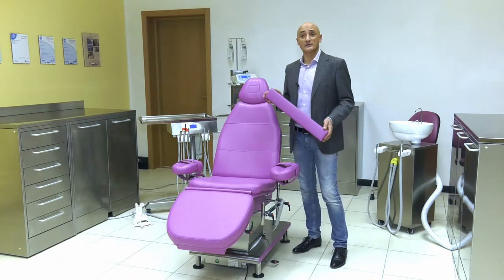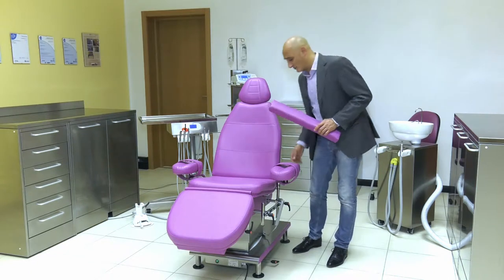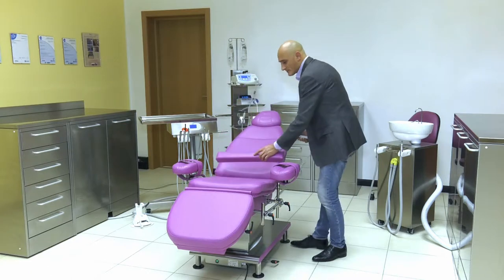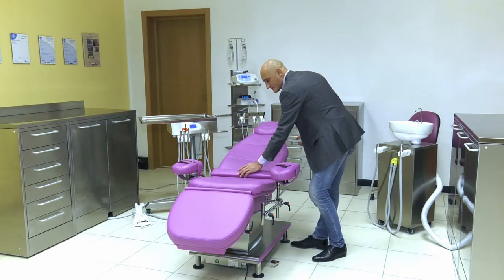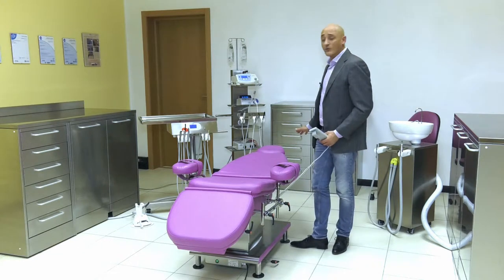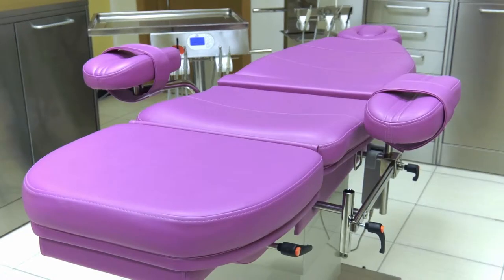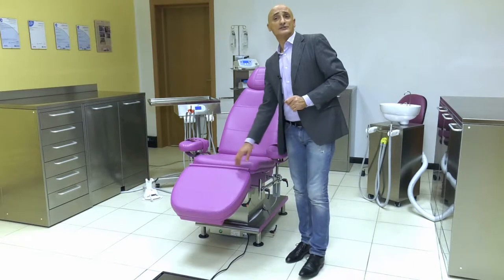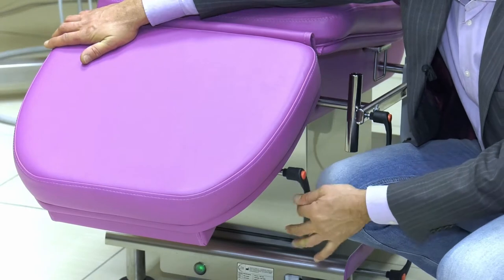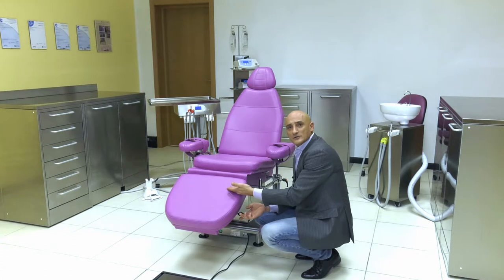We have equipped Morpheus with an insert to fill the space created when the back is fully lowered. When we insert this, we create a bed. It is also possible to increase the overall length of the seating by moving the footrest, loosening the blocking lever and sliding it downwards.